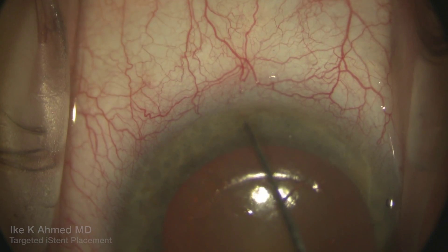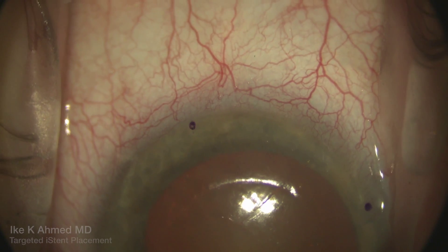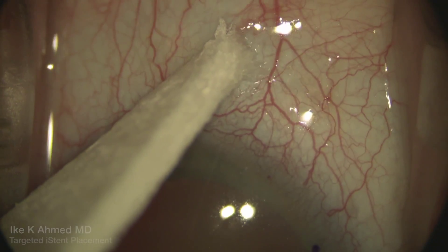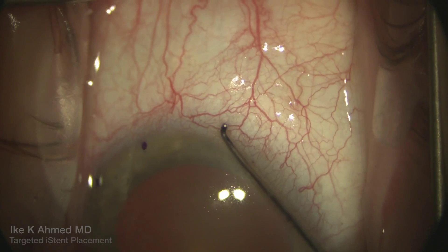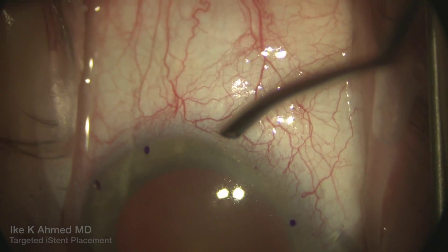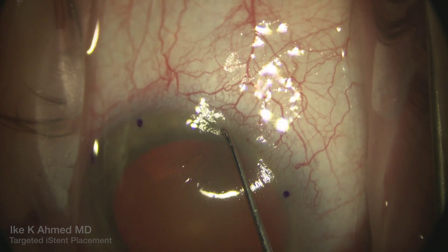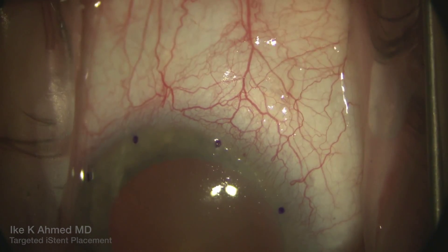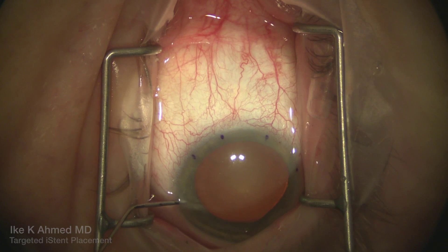We're going to mark the limbal area with ink where we feel these aqueous veins are coming off the canal. This is based on the appearance and positioning of these aqueous veins and the direction they head into the canal, identifying those aqueous veins specifically and differentiating them from the smaller vessels and conjunctival vessels.